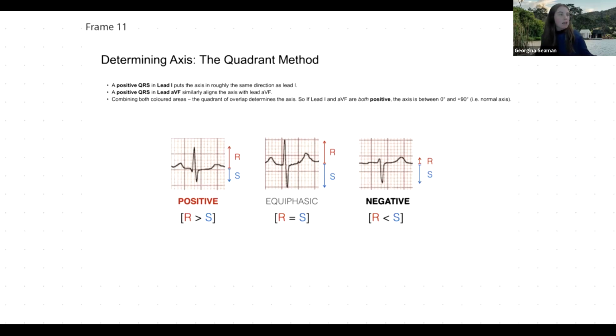Yes, to Katie, PE is a good one. Will we see that more in right axis or left axis, do you know? Absolutely, Chloe. We've got MI, left bundle branch block. PE is right, yep.